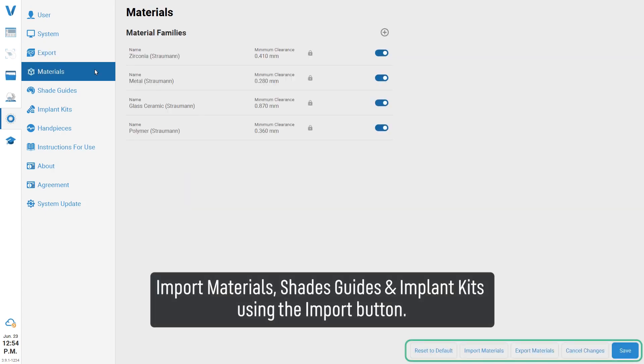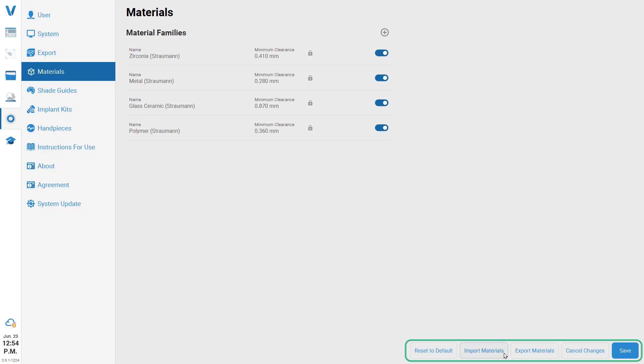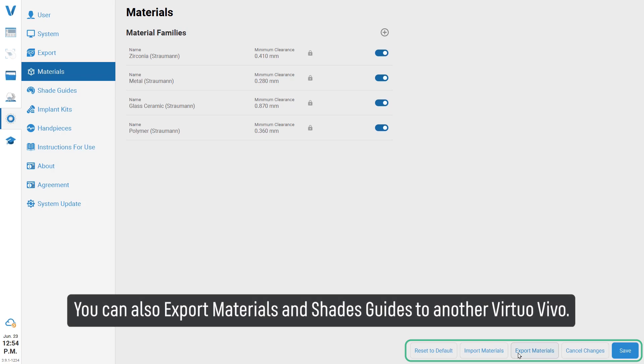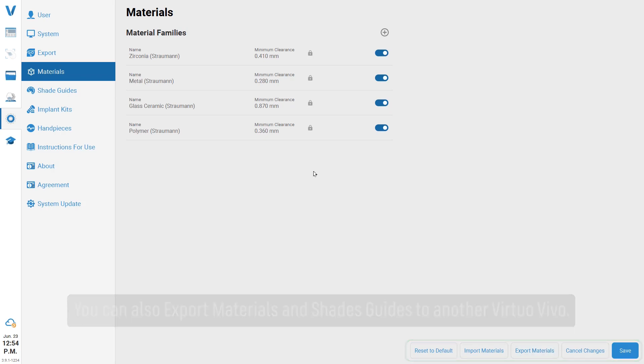Import materials, shade guides, and implant kits using the import button. You can also export materials and shade guides to another Virtual Vivo system.